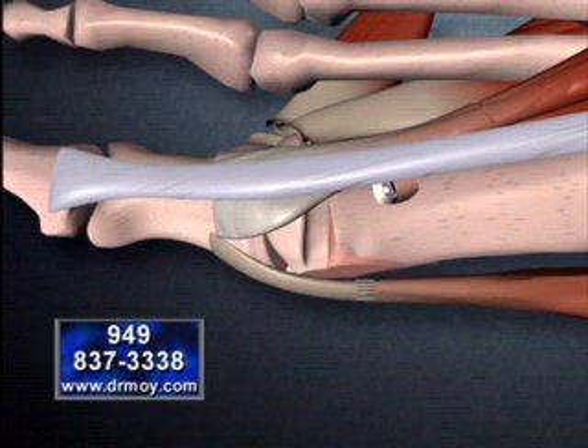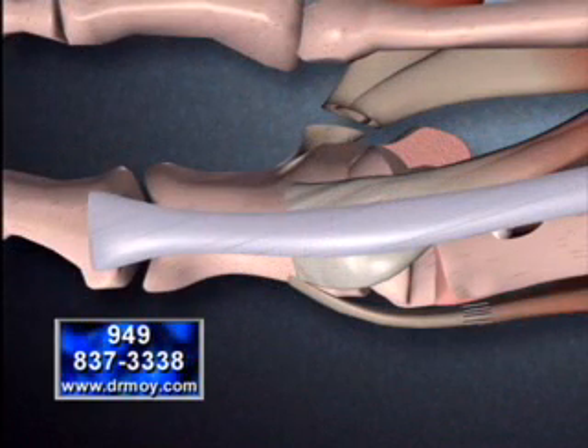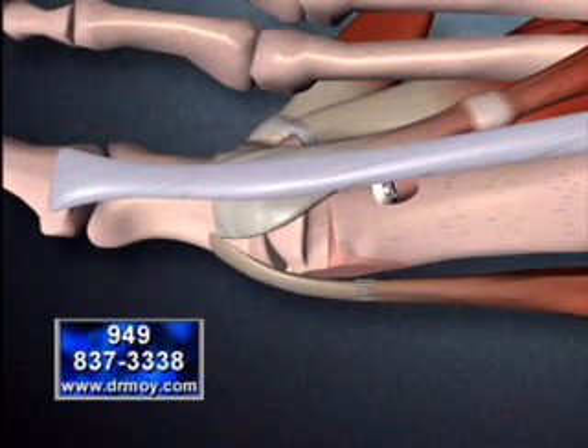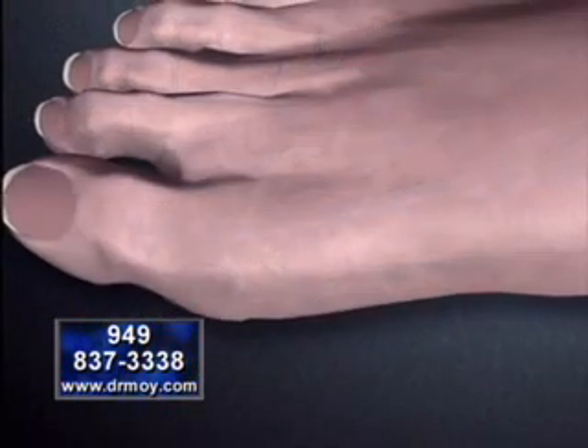The tendon on the opposite side of the long bone will be released if it contributes to the bunion deformity. The tendons that were released will eventually heal and help maintain the integrity and stability of the great toe joint. Finally, we see how the foot has healed in its newly aligned position.